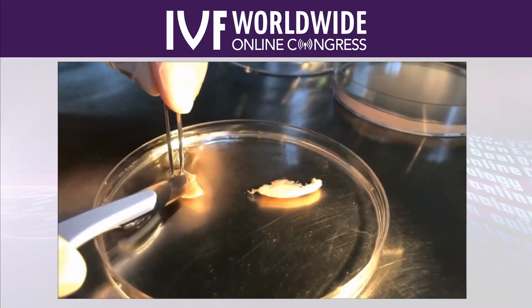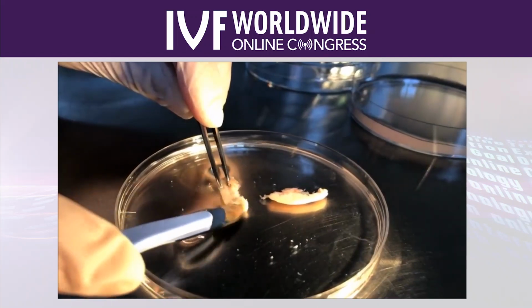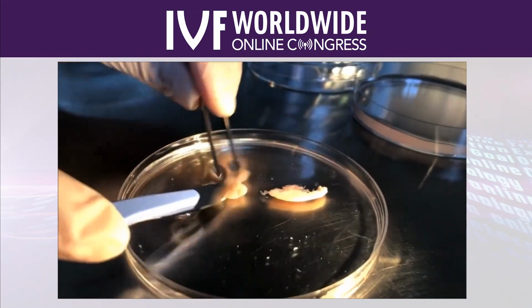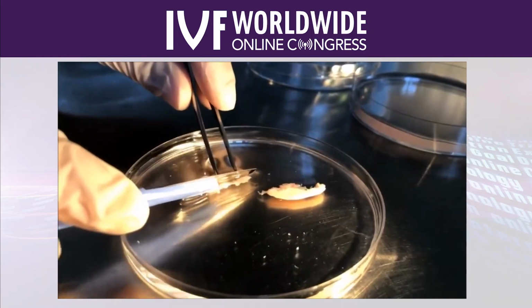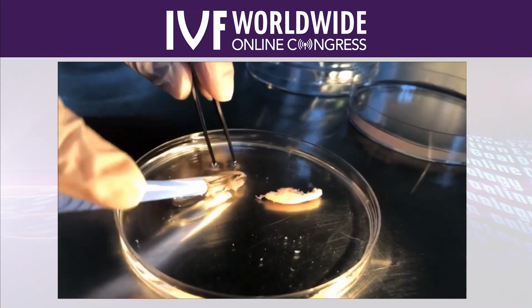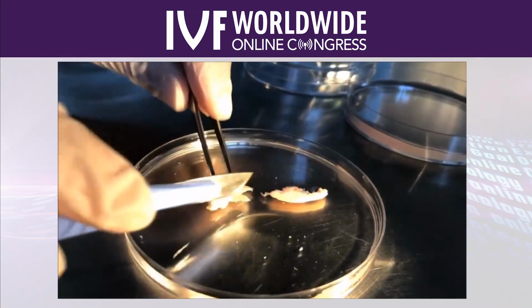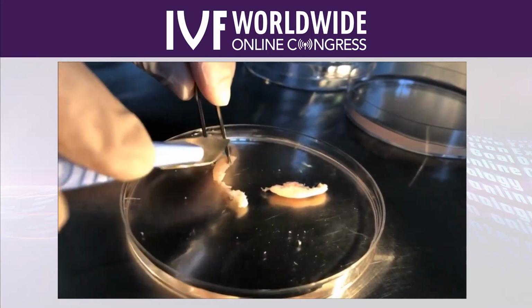medullary parts here. So what we often do with these little girls, that if we're able to isolate some of the medulla, then we also freeze the medullary pieces because they are just packed with follicles. So this is why I'm trying to cut them off in these thin sheets in order to also cryopreserve the medullary tissue.